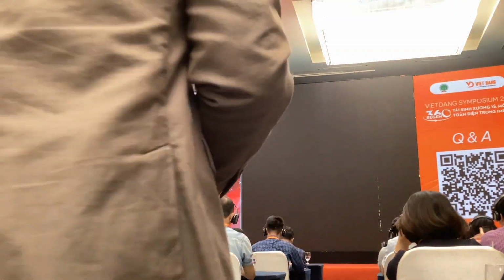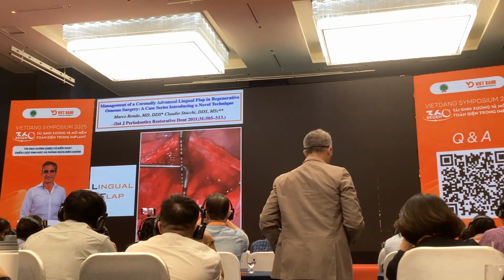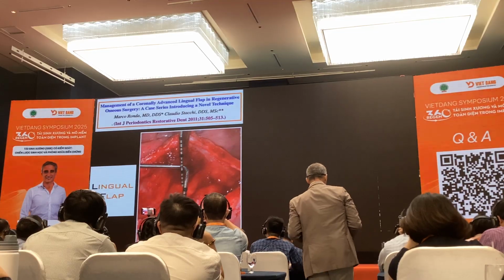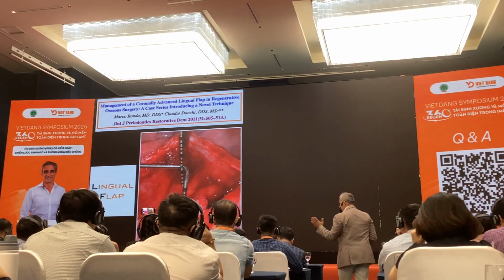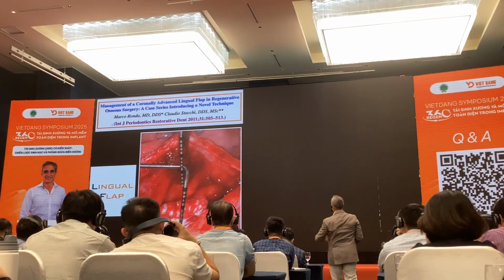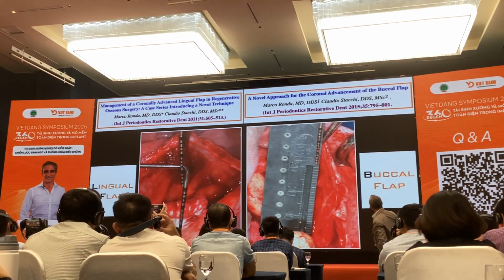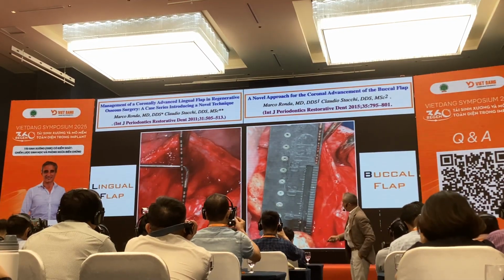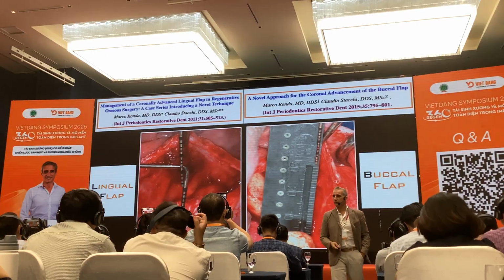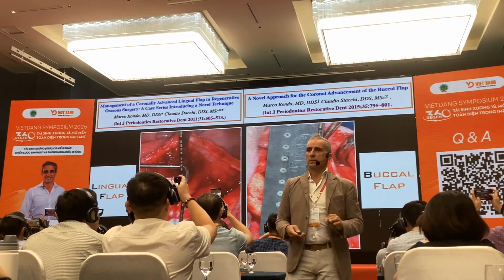3 centimeters of passivation. 3 centimeters. The correct application of the surgical procedure that I published in 2011 for the lingual flap and 2015 on the buccal flap. 4 centimeters for the buccal flap. Without damaging the vessels, no bleeding, never.